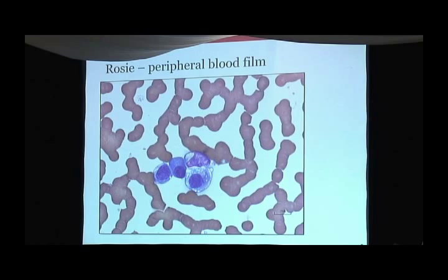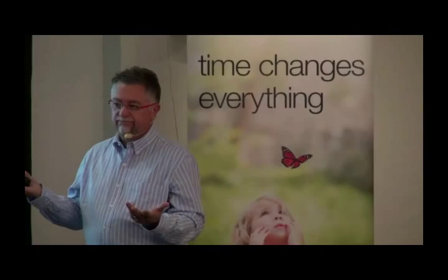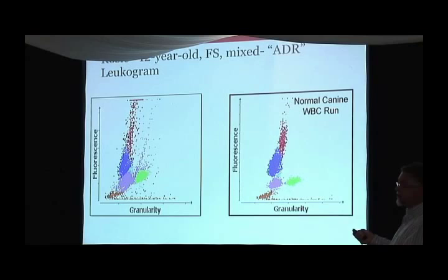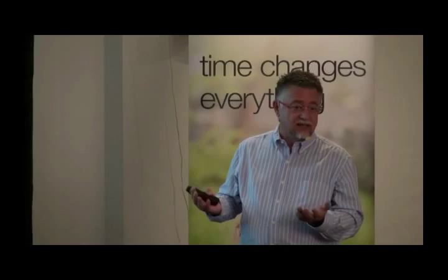So these cells were in circulation, and how did I start with this? I would see all these dots in there and not find any abnormal cells in the smear. And I said, I don't know what these dots are. So then what I started doing is, when I found these dots up there, I started doing bone marrow aspirates in these dogs. And I started finding those with, for example, acute myeloid leukemia that have a normal leukogram and just 20 little dots up there, and I find them in the bone marrow. So again, because you're looking at 18,000 cells as opposed to the few that you can catch in a blood smear.